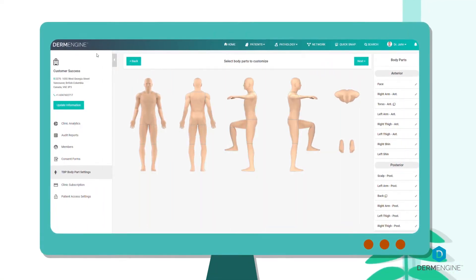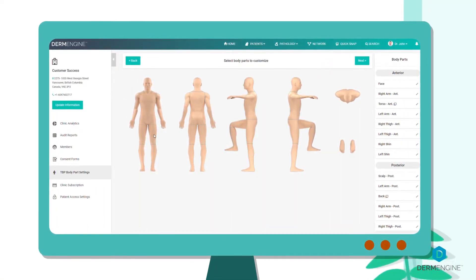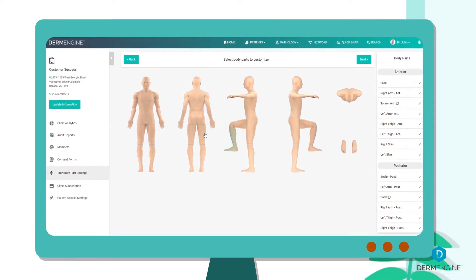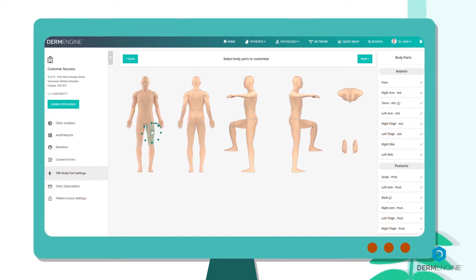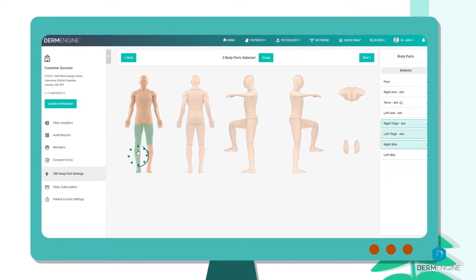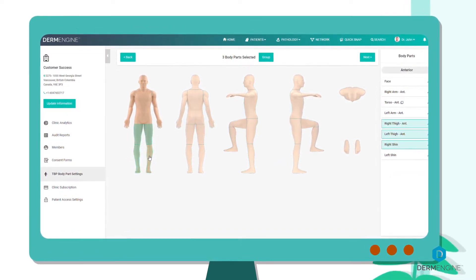Prior to your imaging session, you have the ability to customize the body part groupings. Depending on your selection, the imaging process typically takes 5 to 10 minutes.